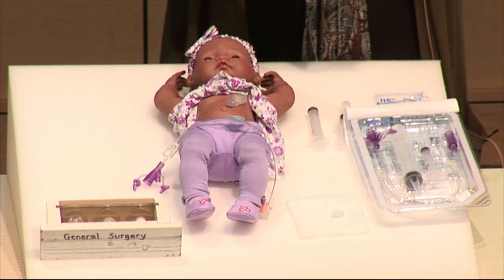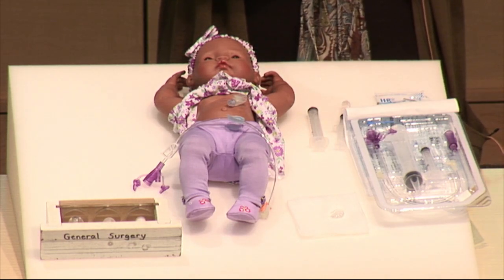You don't have to memorize how much water goes in the balloon because it's written right on the balloon port in nice clear numbers, and this says 4 mLs. This happens to be a 14 French tube. AMTs have a variable balloon fill, so if you were familiar with Mickeys from the past, no matter what size Mickey, all got filled up with 5 mLs of water, but AMTs have a variable fill and it's printed on the balloon port. For example, all the 16s take 6 mLs, all the 14s take 4, all the 12s take 2.5. So you have to look and make sure you know what you're dealing with. And so I'm going to use 4 mLs in this one.